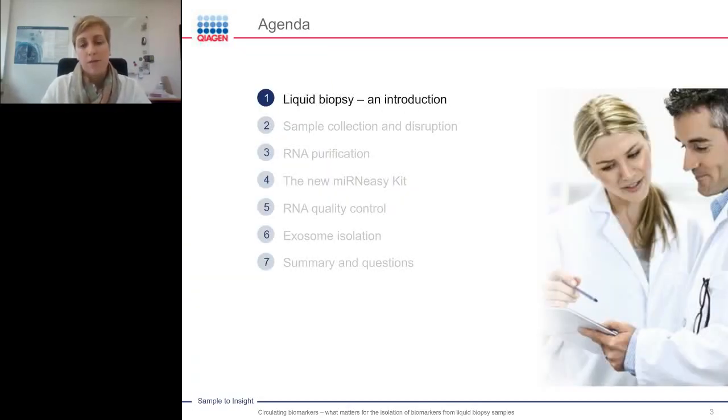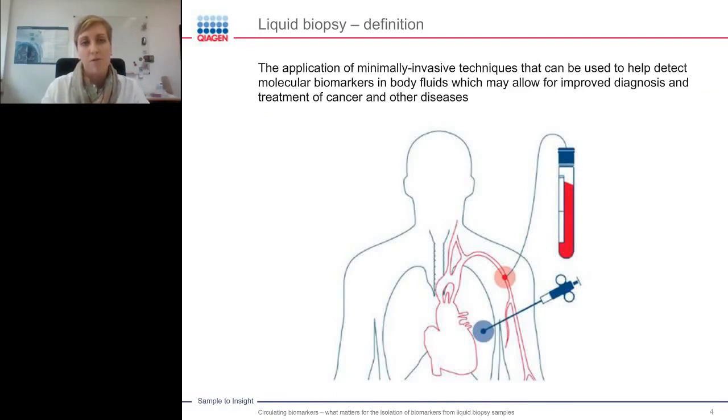This is the agenda for today, and I really want to set the stage by giving you a short introduction to liquid biopsy and remind everyone of what this technique is about. Here is a common definition of liquid biopsy: the application of minimally invasive techniques that can be used to help detect molecular biomarkers in body fluids, which may allow for improved diagnosis and treatment of cancer as well as other diseases. So this definition already tells you that liquid biopsy is a minimally invasive technique and holds really a great potential for diagnosis and treatment of cancer patients and other patients in the future.